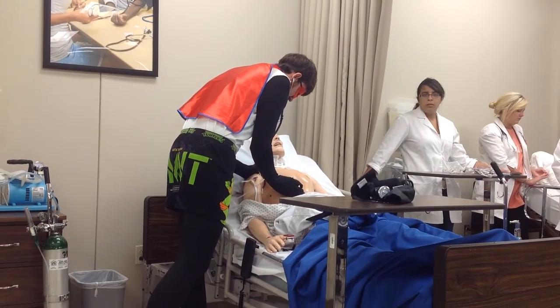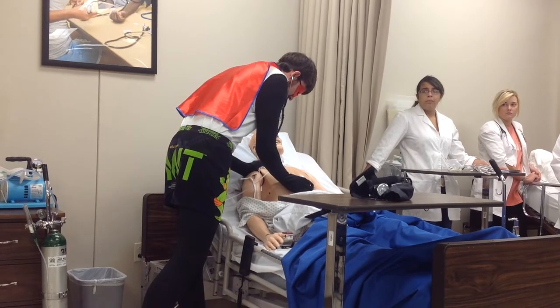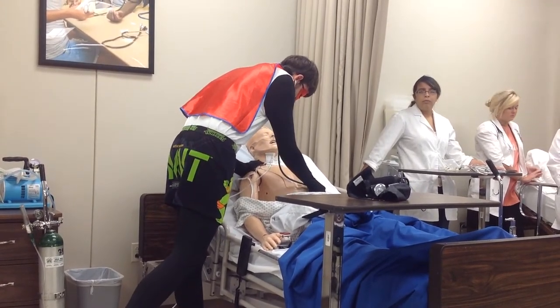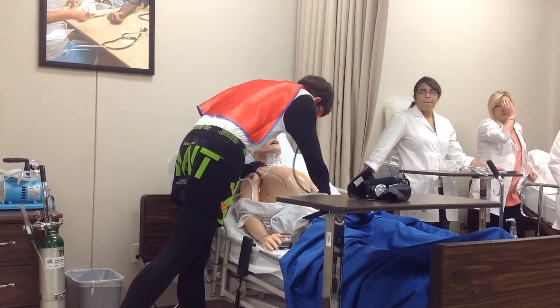And how long do you wait after putting the oxygen on before you reassess? I mean, as soon as you have it on, I'm pretty sure you can start checking. You said 92%? At least above 92. If not, usually that's when they need oxygen.